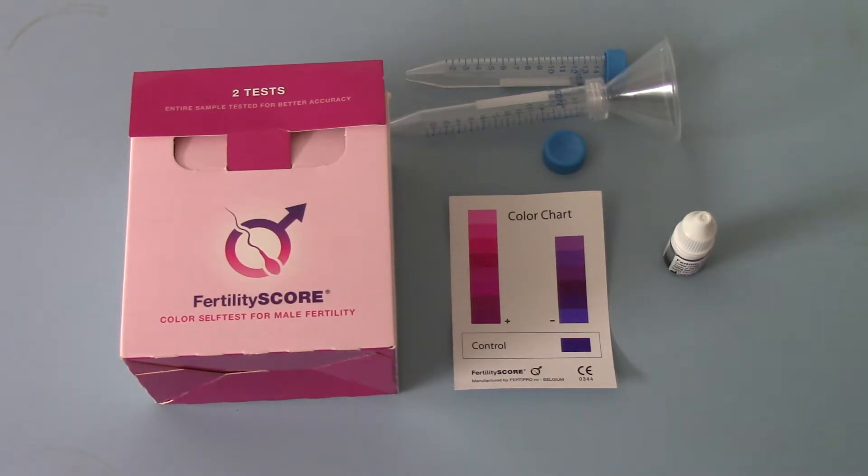Most other tests do not screen the motility — they will just give you a simple numbers game, counting to a predetermined cutoff level at which above you'll get a positive result and below you'll get a negative, whether the sperm are motile or not. And obviously, even if you've got good numbers, if there's no motility you're effectively subfertile.